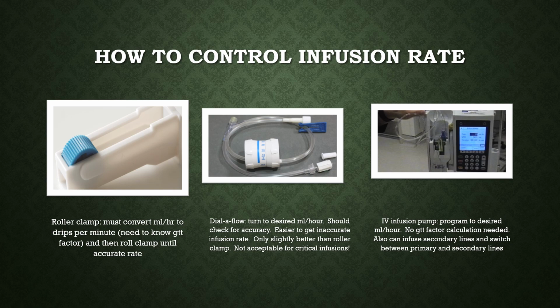In the middle picture, we have what we call a dial-a-flow. A dial-a-flow is this little knob that you turn back and forth.